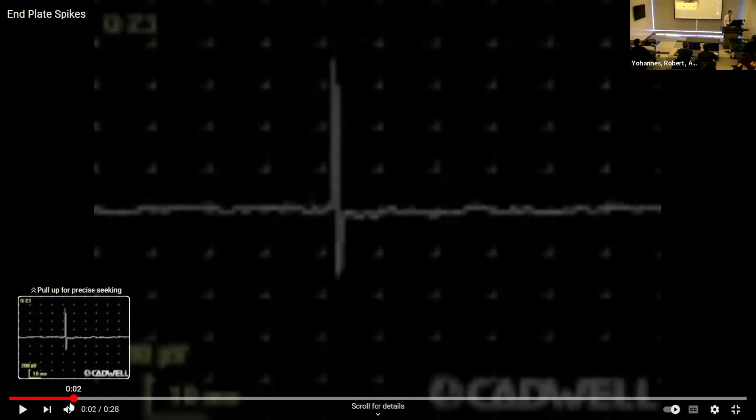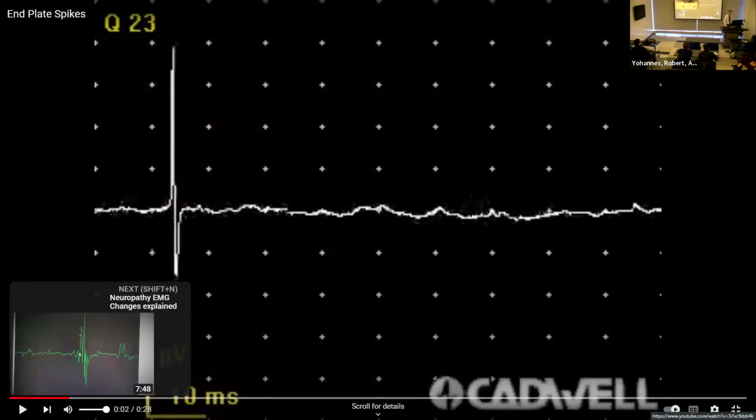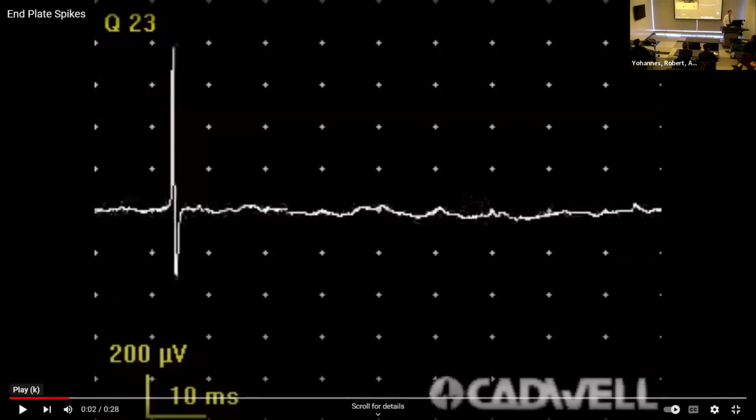By the way, those spikes, I'll convince you that they are not normal units. You see how thin they are? And they don't have the three phases. Now you're world experts. You know there should be three phases, a deflection downward, upward, downward. We don't see it here. Those are not normal motor units. These are end plate spikes. They have this distinct sharp sound, but in the background, with all of this motion outside, try to hear the waves over seashells. Let's see if I can convince you.